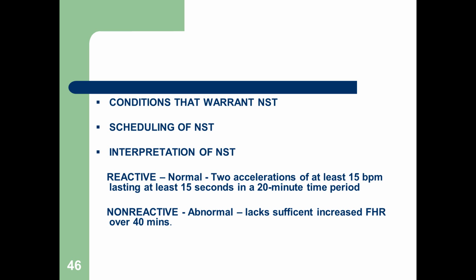Okay. Other indications for non-stress test: if the patient has a history of a stillbirth, chronic renal disease, decreased fetal movement, like they haven't felt the baby move, they're going to do a non-stress test. If the mom has sickle cell, or is anemic, they're going to probably schedule a non-stress test.